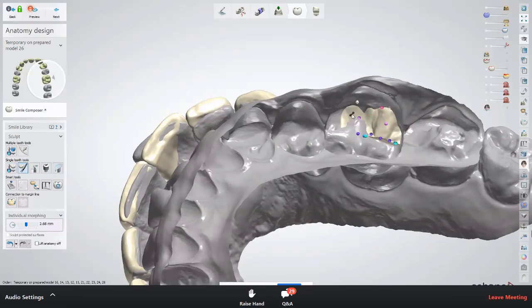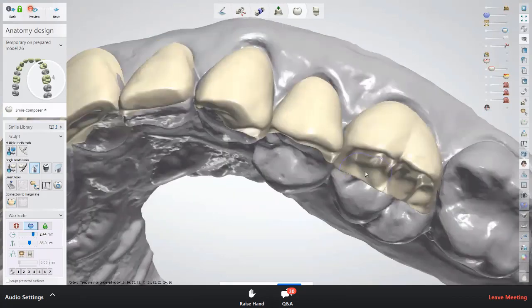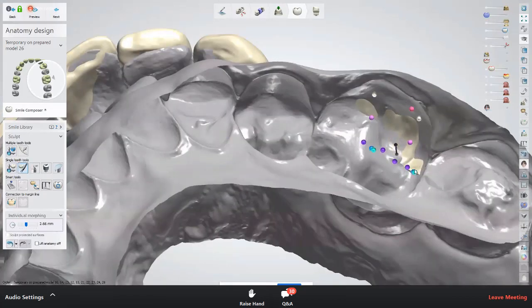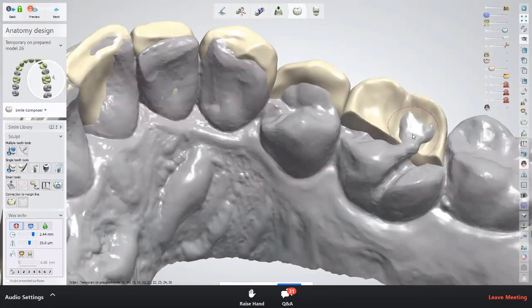So it's really important to make the patient understand that the plan, the smile design, is the first plan, the first stop. However, we're going to need to make a wax up for you to actually see if it's going to work in your mouth or not. And the nice part of doing additive wax ups also is that the doctor can actually try this in on the patient at the next seating and see if it works for the patient or not.